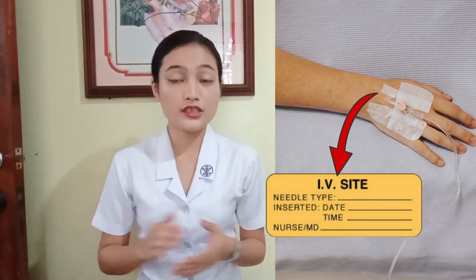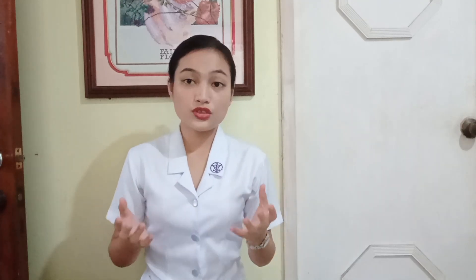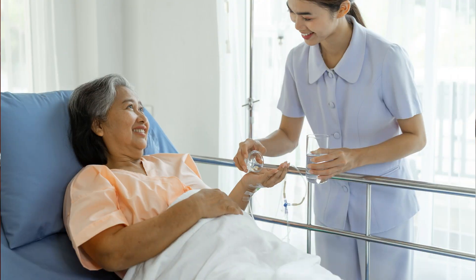After that, we can now regulate the flow of the infusion of the fluid. This is done to ensure that the patient would receive only the right amount of fluid as prescribed by the doctor. Next, we'll have to place a label near the IV site indicating the date of insertion, the type, and the gauge of the IV catheter used. This is to ensure that we know when we should replace the IV catheter. We should also place a label on the IV tubing to indicate the date of when the tubing should be replaced. Next, we'll have to observe the patient for a couple of minutes for any untoward effects so that we can provide prompt treatment if needed.